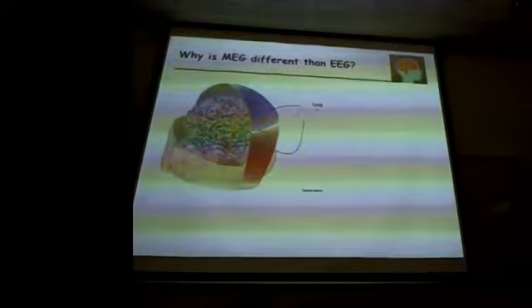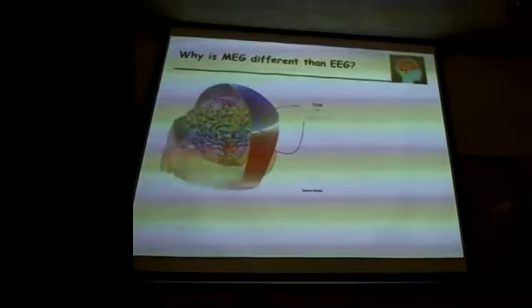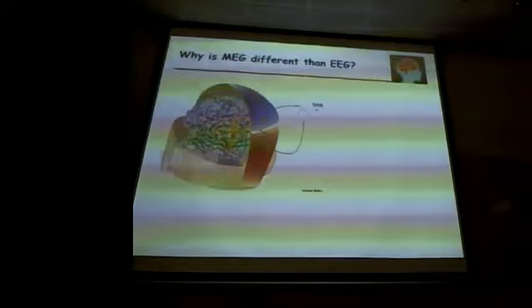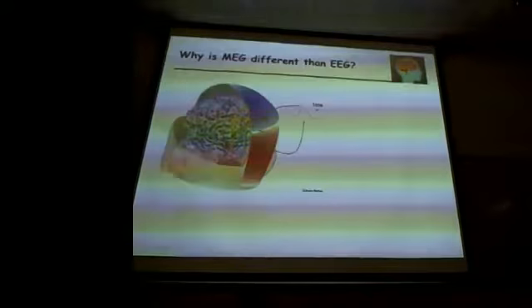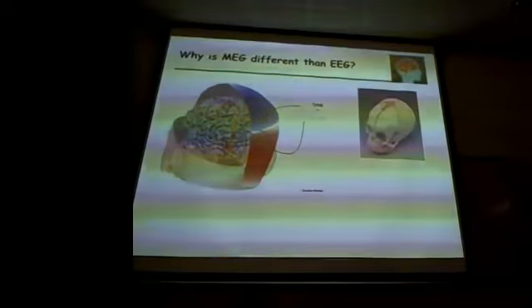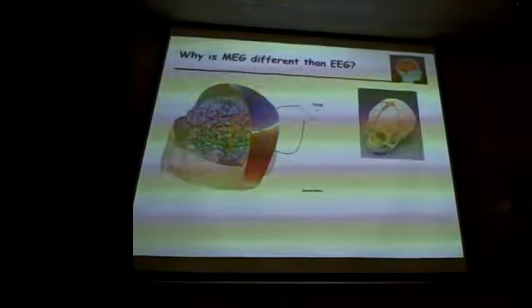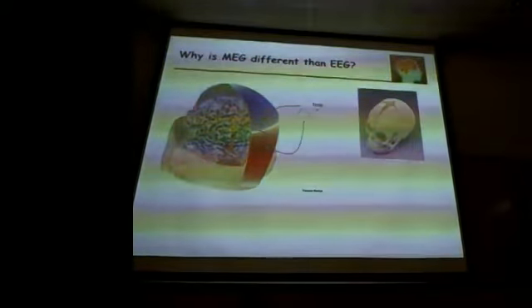There are a few things that look like there might be some interesting activity if you collect data at faster rates, but there's no reason to go beyond 10,000 hertz as far as we know. So this is just another topic to talk about with regards to the skull.